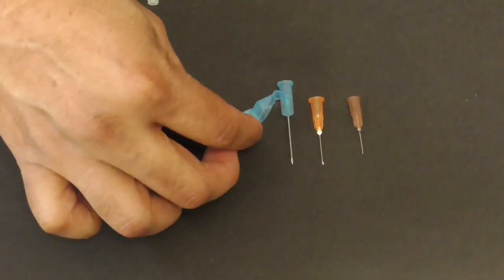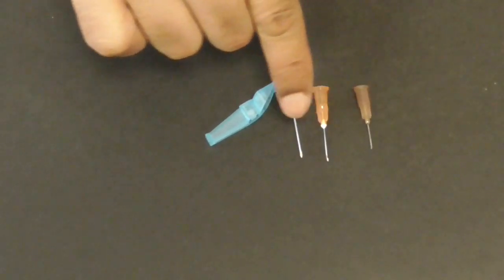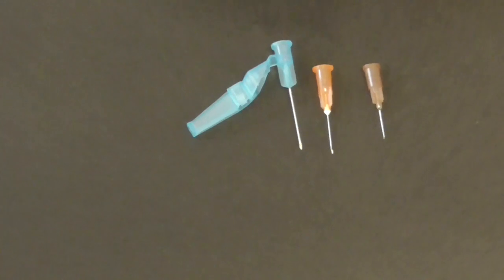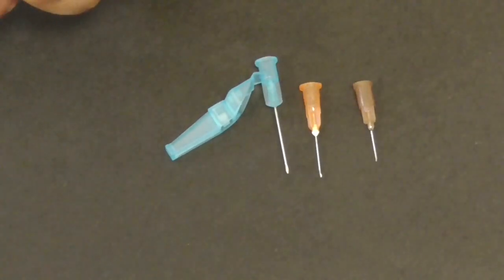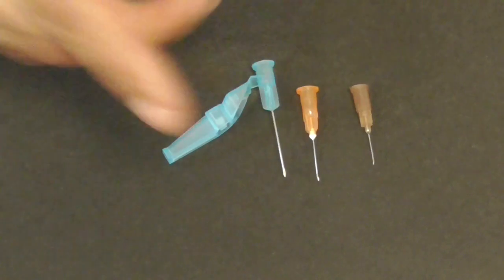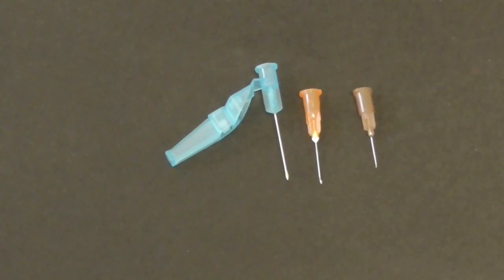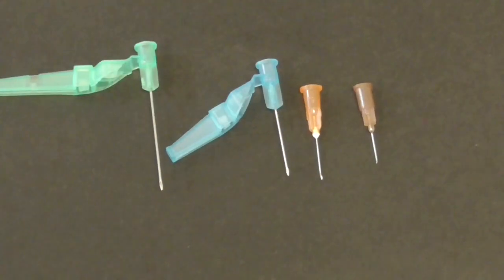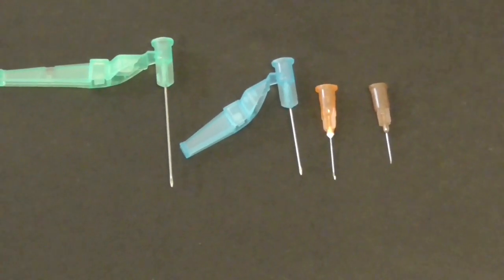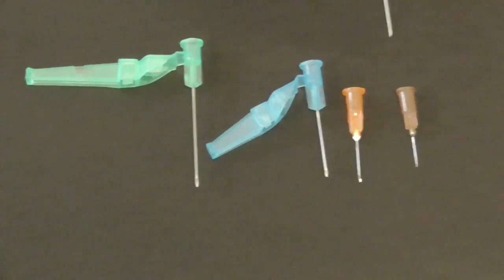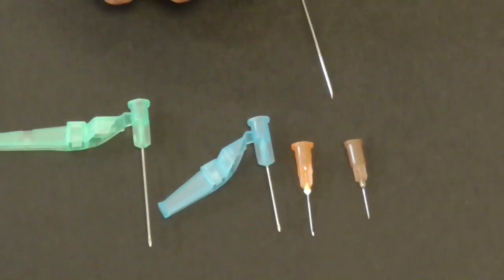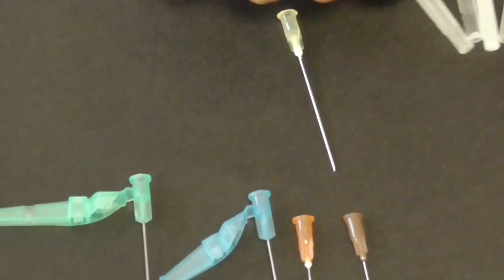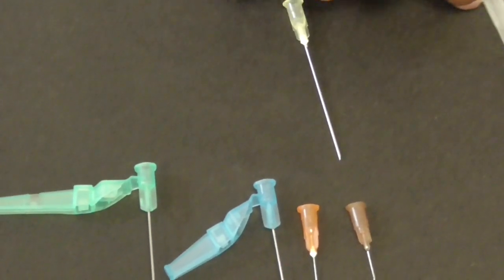This one's a 23 and this is as you can see slightly bigger. I know they look like different lengths but the length is not determined by the gauge it's actually the size of the needle, how much fluid can go through it in one push and then you have this one which is a 21 gauge and this big beast of a needle that's a 19 gauge needle so you can see that they're getting fatter as they go along.